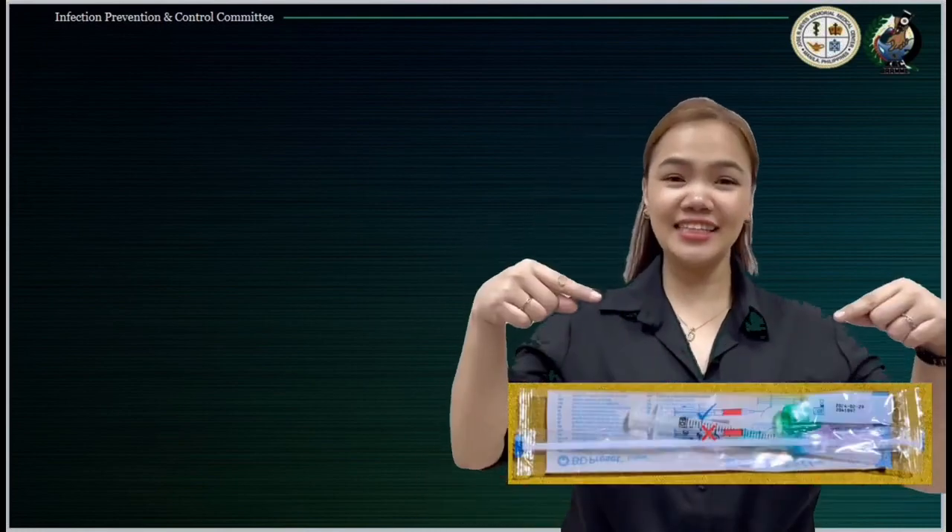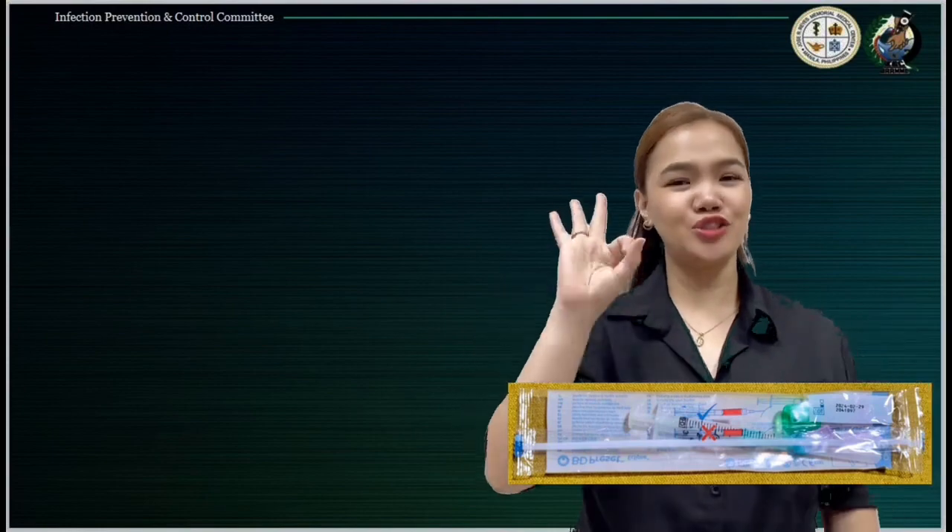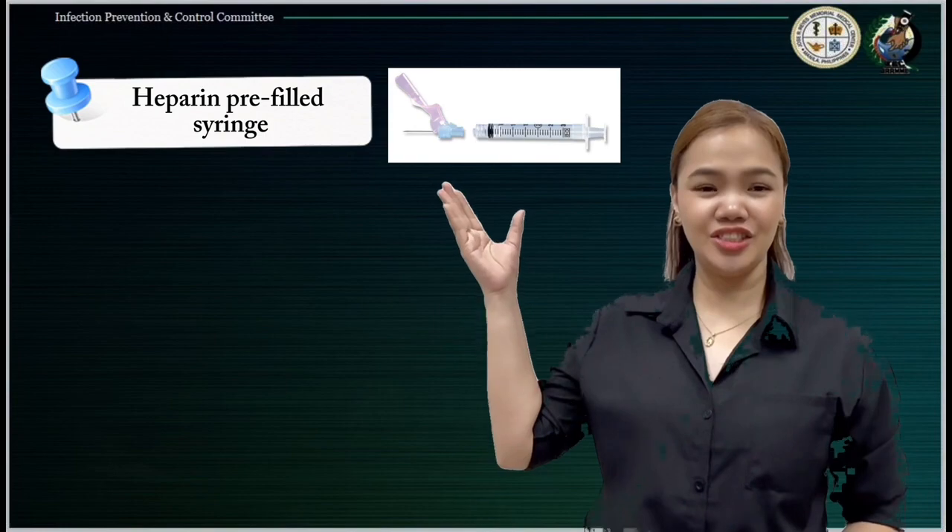I will later demonstrate how to use it, but first, let's identify the contents. Inside this sterile package, we have three items. First, the heparinized pre-filled syringe.